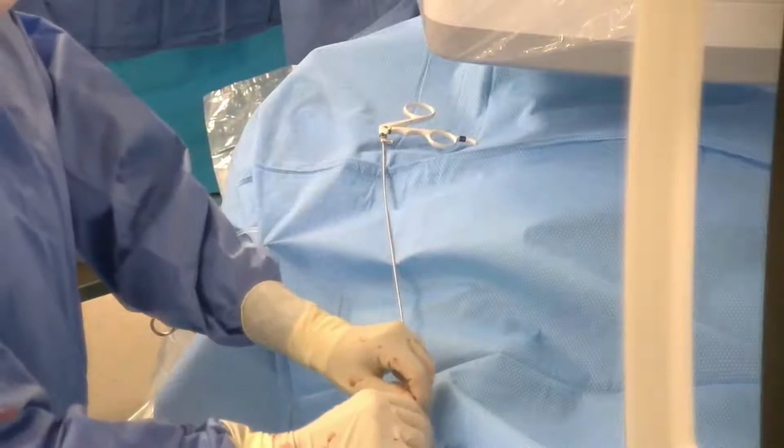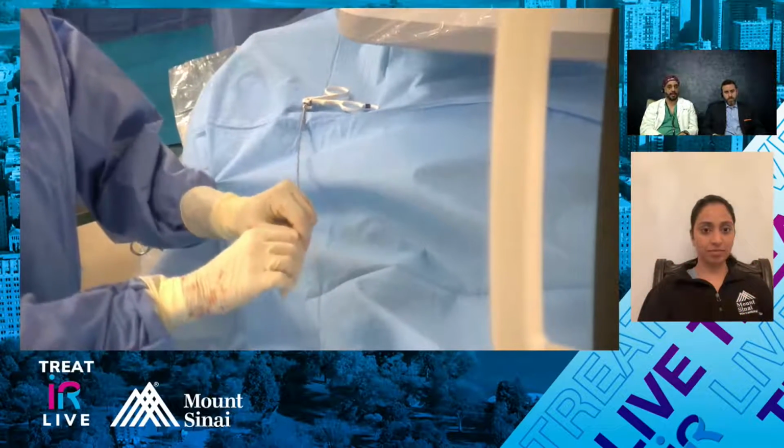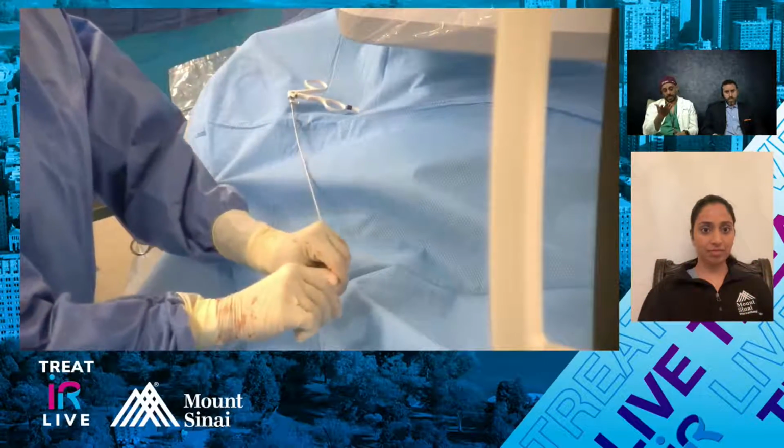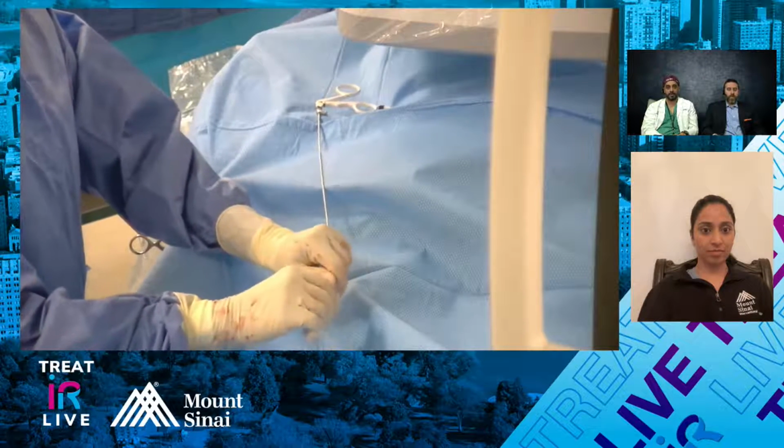Go ahead. So, Raj, I know we talked a little bit about this earlier, there are different pitfalls that can come up with the forceps, right? One thing obviously is they come straight. The straight doesn't usually work because you have to get it off the wall. So we put a little tilt on it.